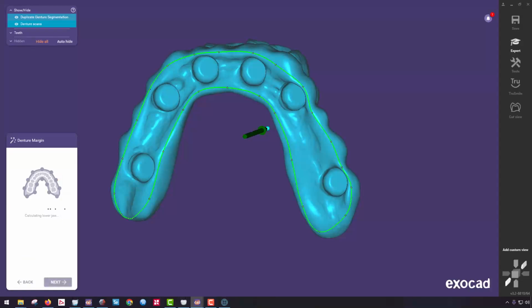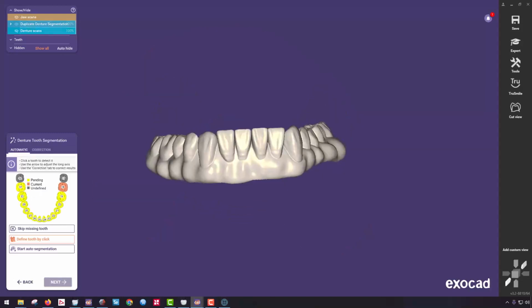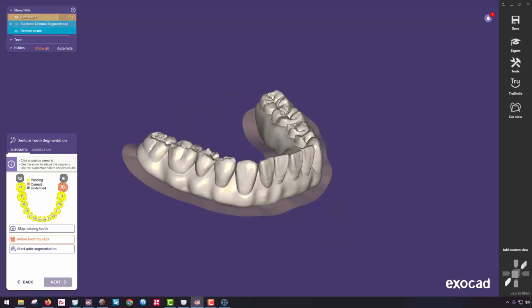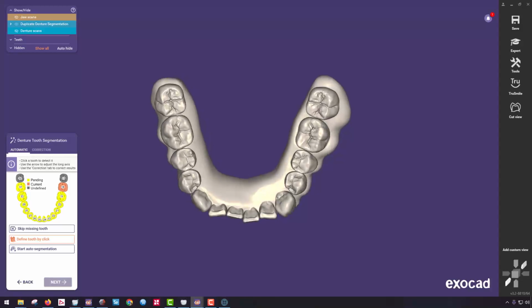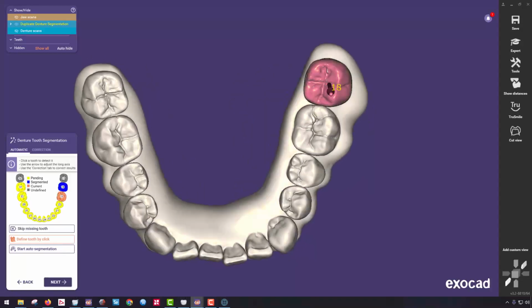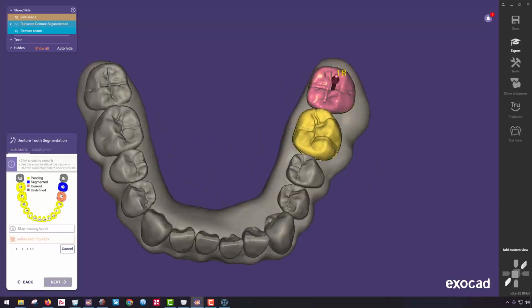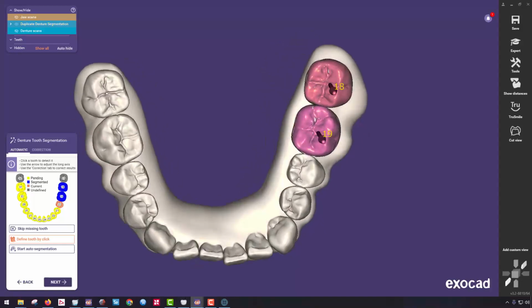What this software does is pretty cool. It builds this quickie little model based upon that scan. So I'll turn that on and off so you can kind of see it. It's pretty cool. I'll come back to that because you'll see it more often. Now at this point, we're ready to define the teeth. Usually I can do it with a single click, by clicking in the central fossa of the posterior teeth. It says tooth number 18. It outlines just like so. Perfect. Click the center of tooth number 19. If something needs to be adjusted, I'll show you as an example when we get to the last tooth, unless it does it for some of the others.